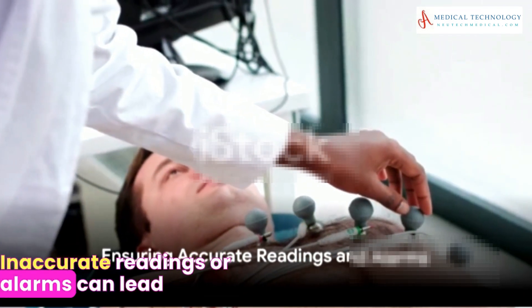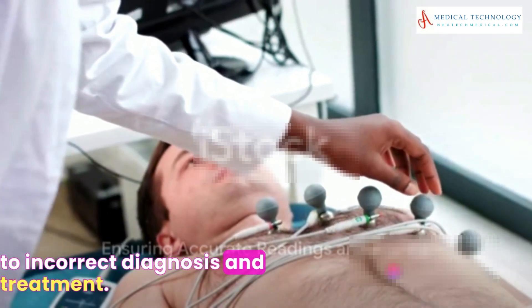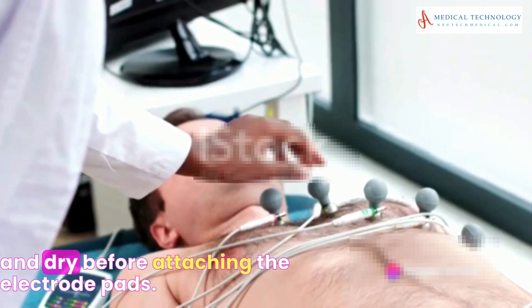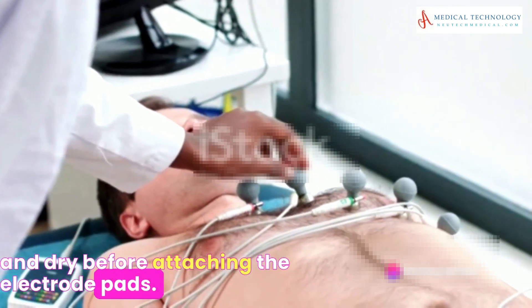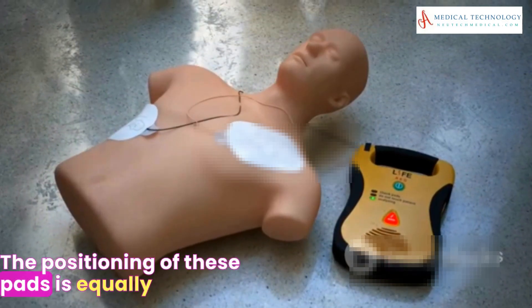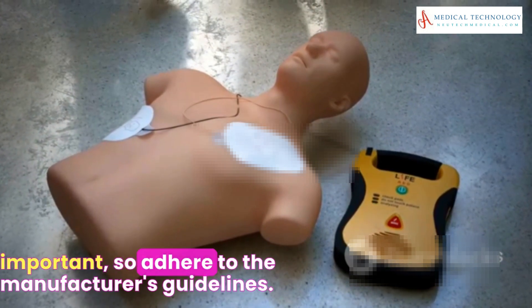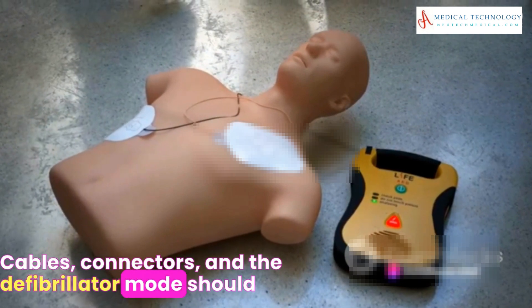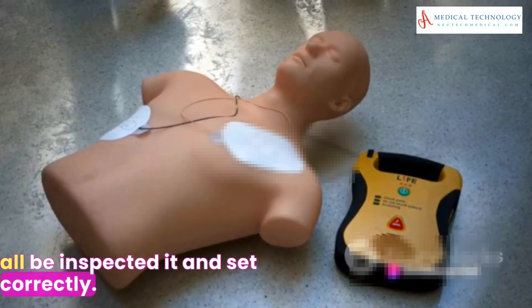Inaccurate readings or alarms can lead to incorrect diagnosis and treatment. Therefore, always ensure the patient's skin is clean and dry before attaching the electrode pads. The positioning of these pads is equally important, so adhere to the manufacturer's guidelines. Cables, connectors, and the defibrillator mode should all be inspected and set correctly.